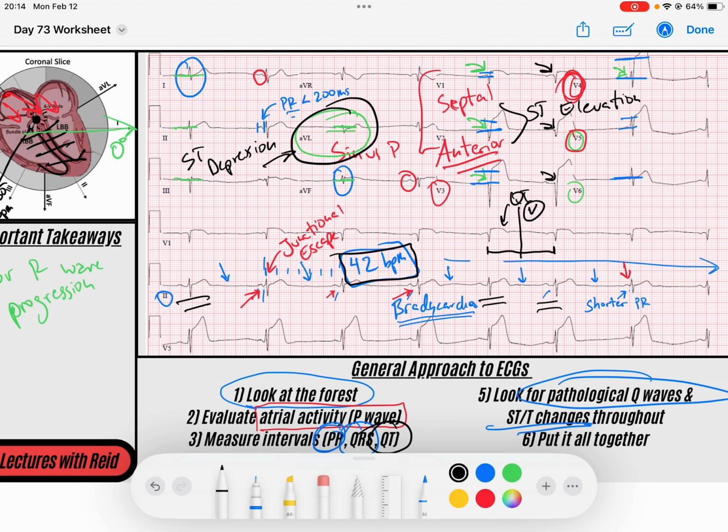And so, what artery supplies this, right? And we think, why do we need to have a certain anatomical distribution? Well, a myocardial infarction is an occlusion of one of the coronary arteries. And so we know that the left anterior descending, or the LAD for short, is what supplies most of the anterior aspect of the left ventricle, as well as some of the septum.